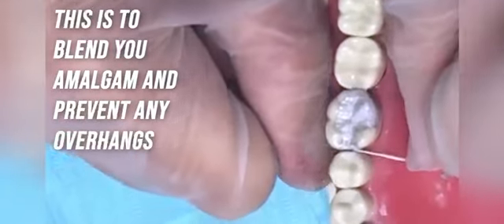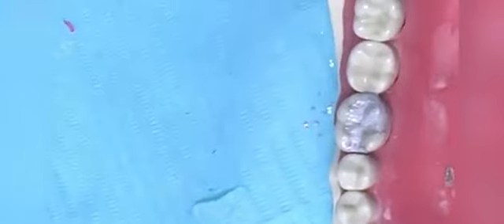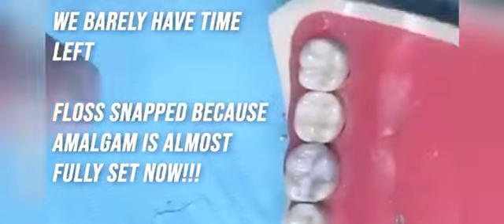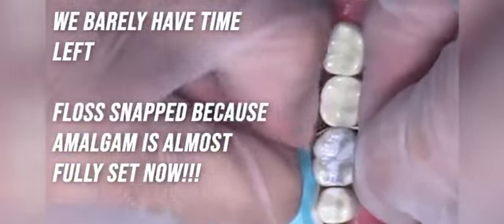Here we are checking the contact. Contact should not be too tight or too light. If there is no contact, it directly fails. If it's too tight, it means there is a cervical overhang, you have not done the separation enough, and you have not done the burnishing of the band enough. So try to select the proper wedge. Number 3 wedge is, I think, enough every time. They give a wide contact mostly. And try to burnish your band very well.